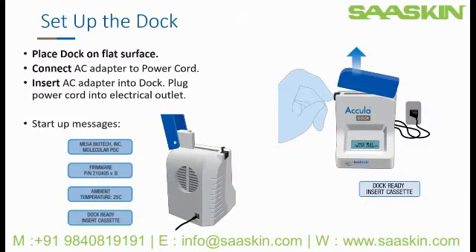If you have not already done so, you will need to set up the Acula or Solaris dock. To do so, place the dock on a flat, stable surface. Connect the two cord pieces together, plug in the dock, and plug it in to an electrical outlet. The dock will automatically turn on and show a series of startup messages.